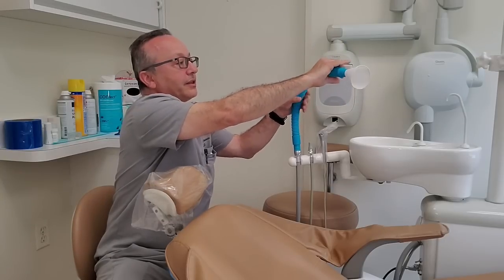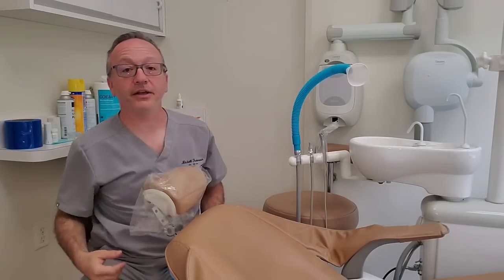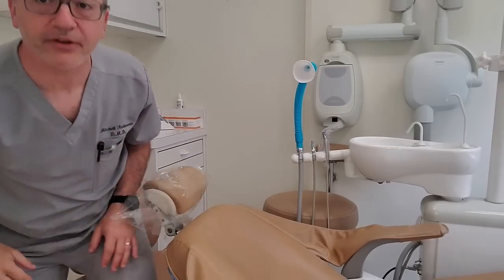You bend it a little bit so it's generally in the right vicinity. It's moving a lot of air — you can hear it and you can feel it. If you were here, you could feel it. Kind of move it in the general direction of your patient's face.